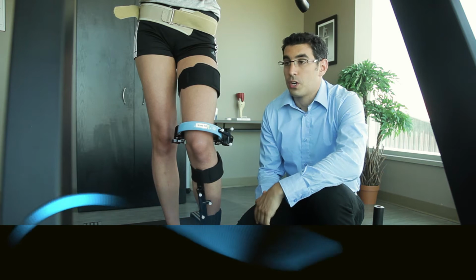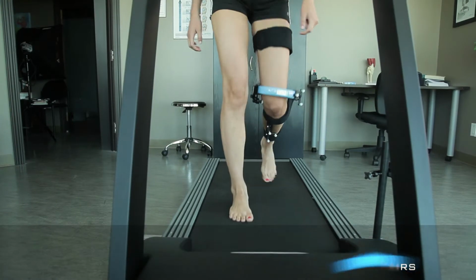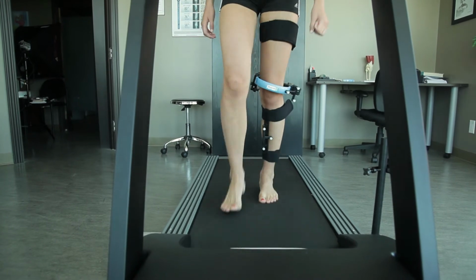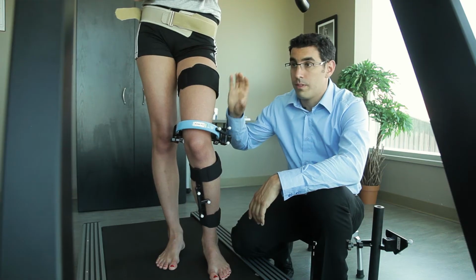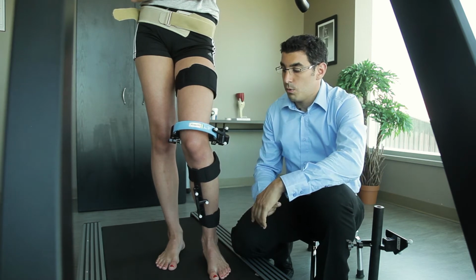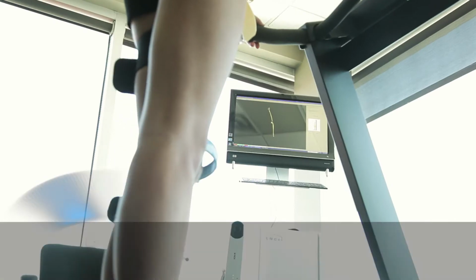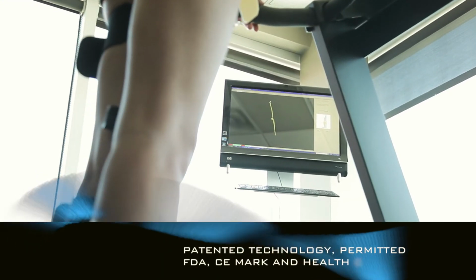The KneeKG is a marker attachment system that allows us to track the movement of the tibia, so the bone of the shank, in regards to the movement of the femur, the bone of the thigh. And while the patient is walking, so in a functional task, we're able to quantify and look at what's happening in 3D of the movement of the tibia in regards to the femur.